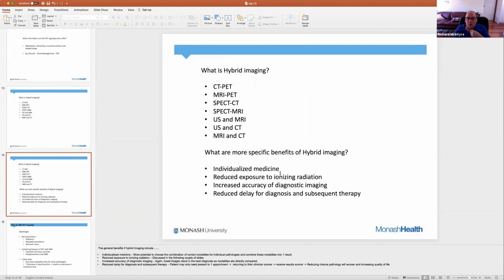So when we talk about our three-year-old with a lesion, we don't want to give them a PET CT scan every 3 months because that's going to increase their level of radiation. So we're going to give them a PET MR scan so they have a relatively small amount of radiation, and they have an MRI scan every 3 months rather than a CT scan. So over the years, when that child becomes 20, 30, even older, their radiation exposure will be dramatically reduced because they won't have had to have a CT scan every 3 months.